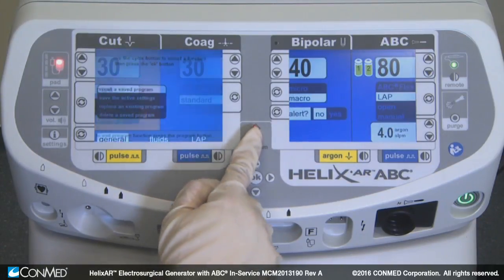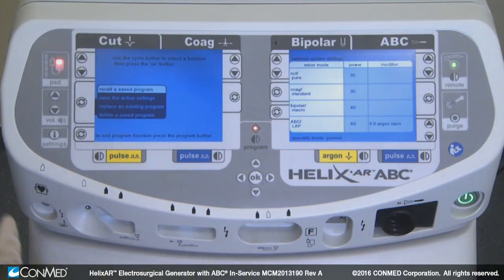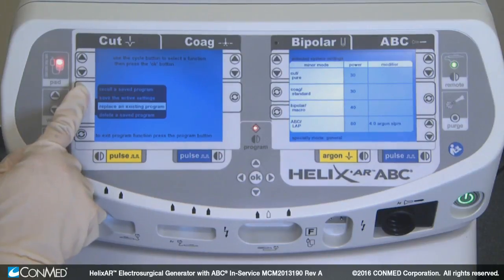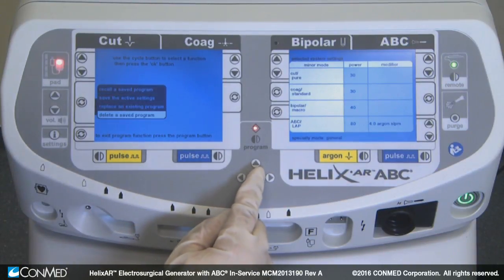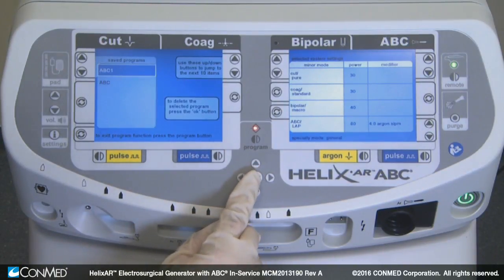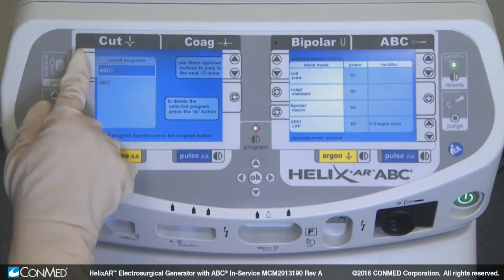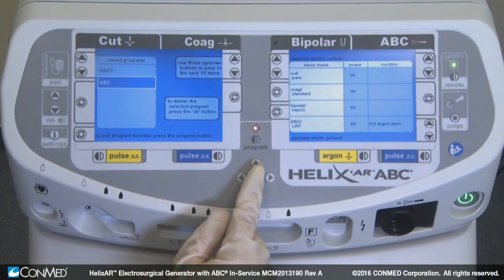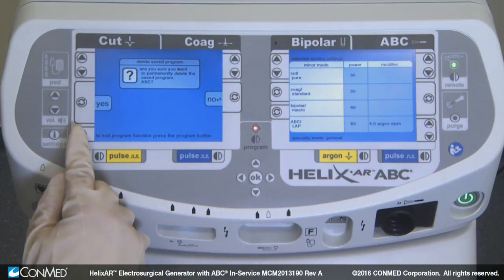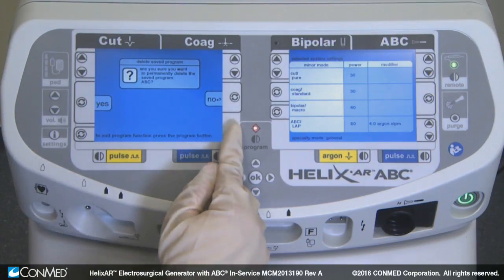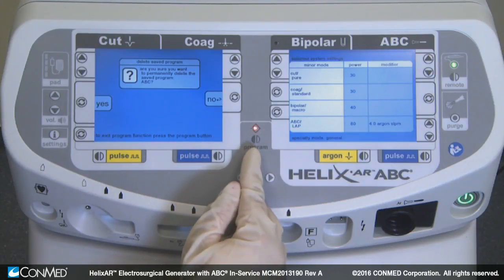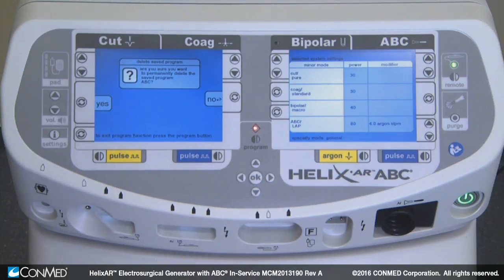To delete a saved program, push the program button and select Delete a Saved Program. Press OK. Then select the desired program to delete and press the OK button. Choose Yes to confirm, or No to return to the previous screen. Press the program button to exit program mode without deleting a program.